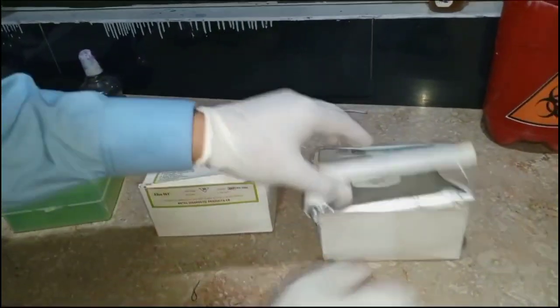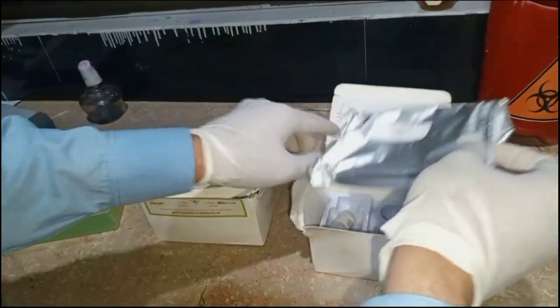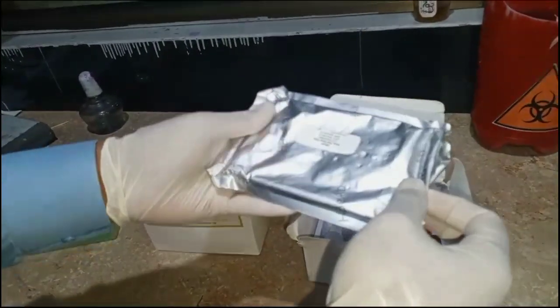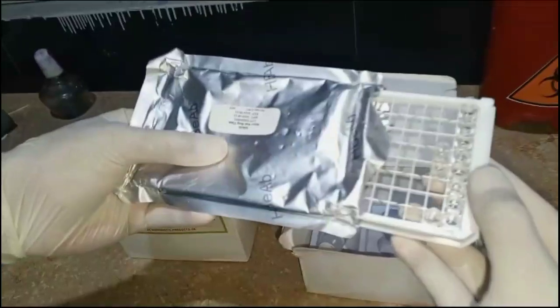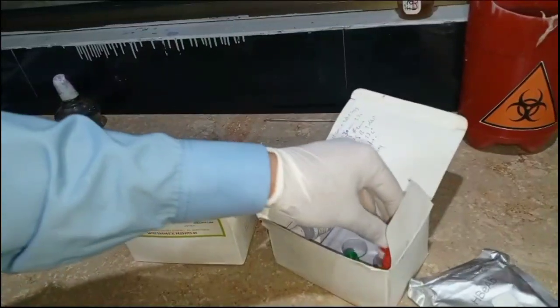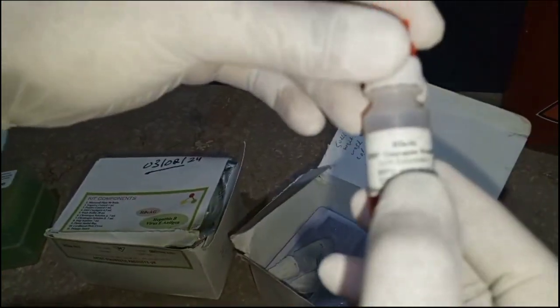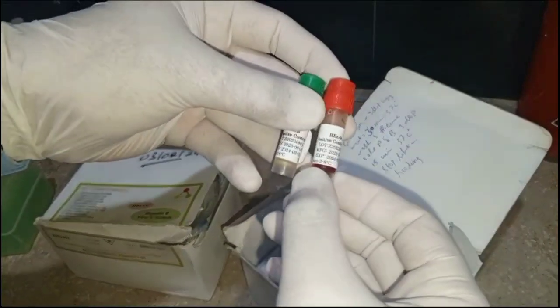Now let's see what this kit contains. First of all we have the ELISA HBeAb kit. It contains the wells, as you can see. These are the wells of HBeAb. This well is coated with the antigen, so when antibody is present in the blood, it will be detected. This kit also contains the conjugate. It also contains the positive control as well as the negative control.